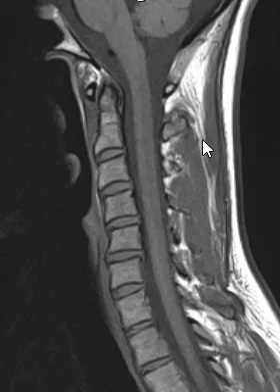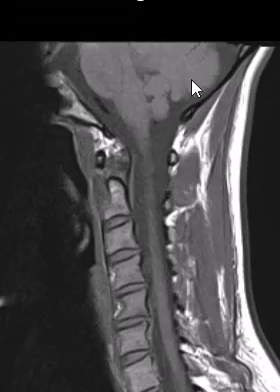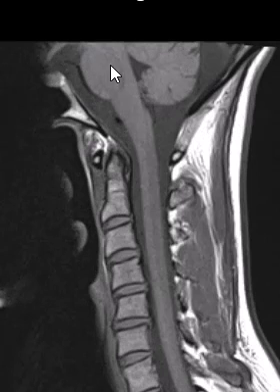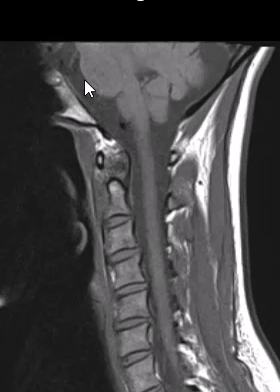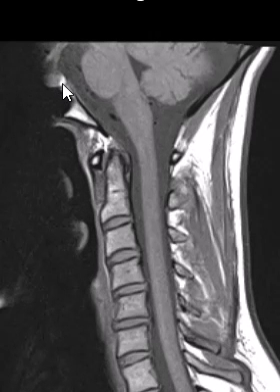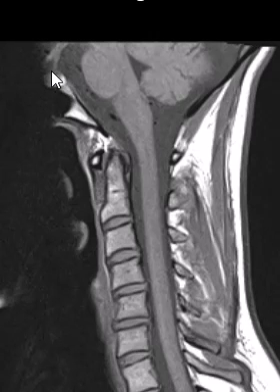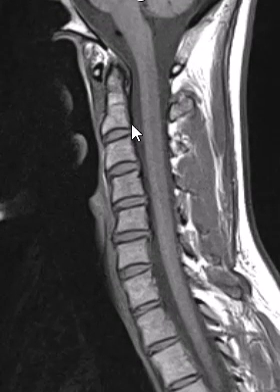Now we take a sagittal side view where we can see the front and back. Sliding down we get a look at the cerebellum and brain stem — this ovoid structure is the pons, and the medulla becomes the spinal cord going down through the neck. We also see the pituitary gland with its stalk, and the bright spot in back is the posterior pituitary, which is a normal finding.